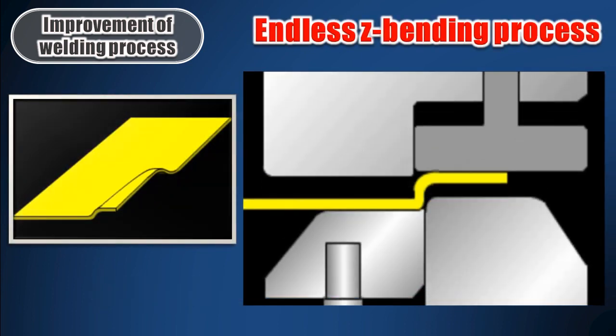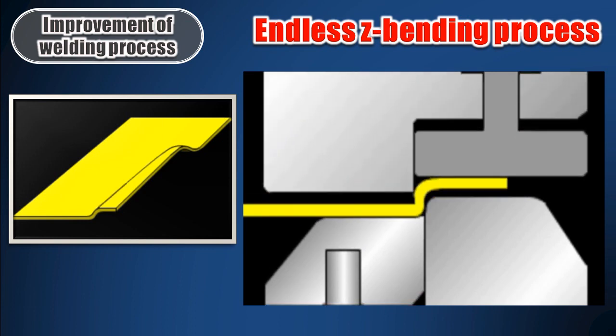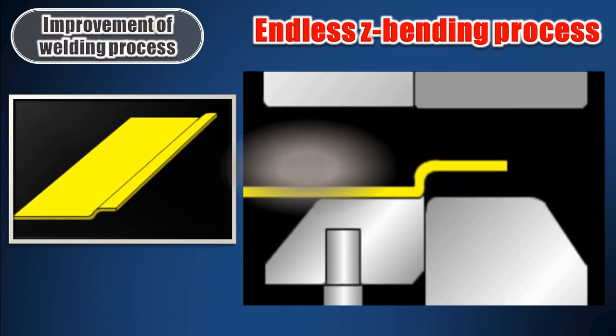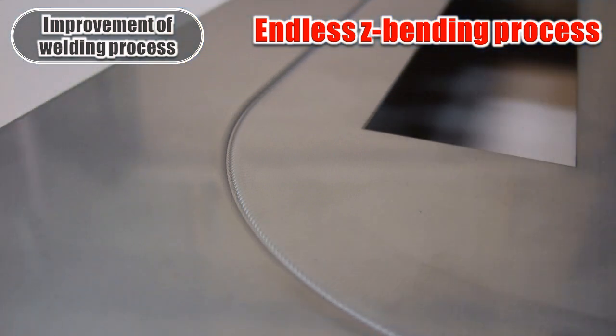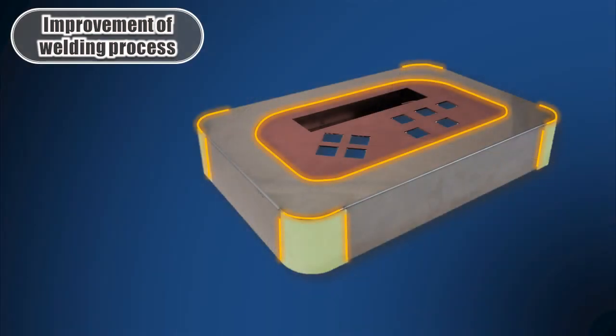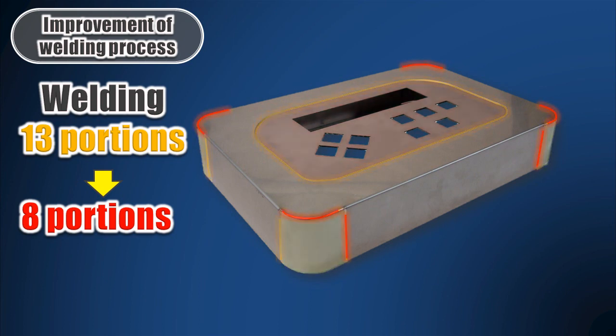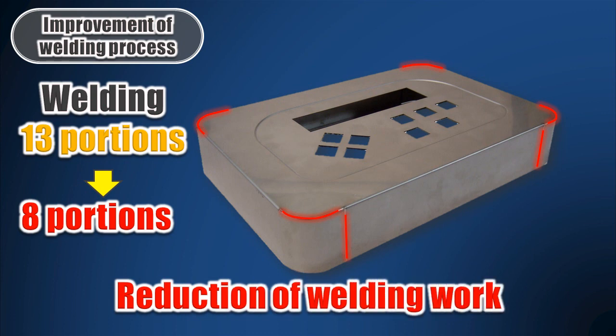Endless Z-bends make level differences by feeding pitch. A variety of shapes can be made depending on the program. As a result, the weld sections are reduced from 13 to 8. Furthermore, the position of parts for welding are also reduced, so we can expect significant lead time reduction.